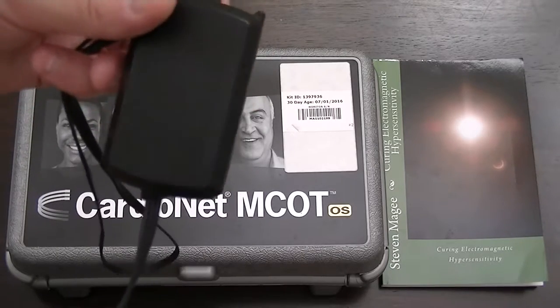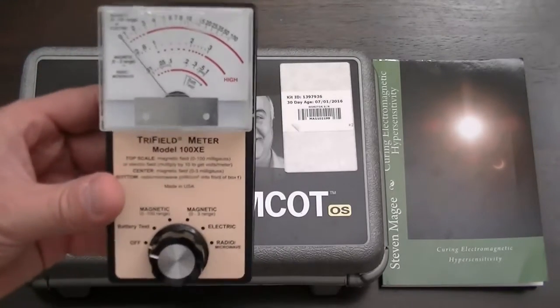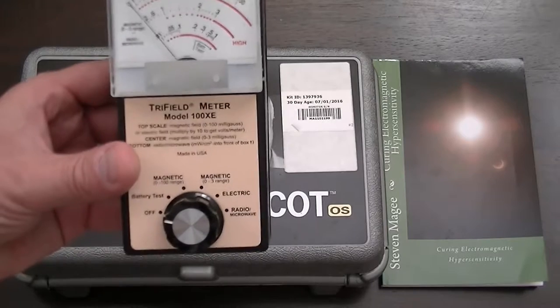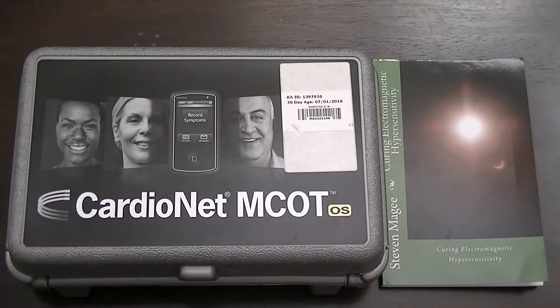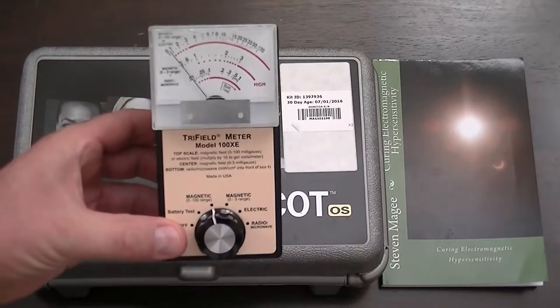So what we're going to do is have a little look at what it's actually doing with this meter. This meter is a Trifield 100XE electromagnetic field meter, and we're going to go through the various ranges that it has. I'm going to turn it on to the first setting, which is magnetic, and we're on the 0 to 100 range.